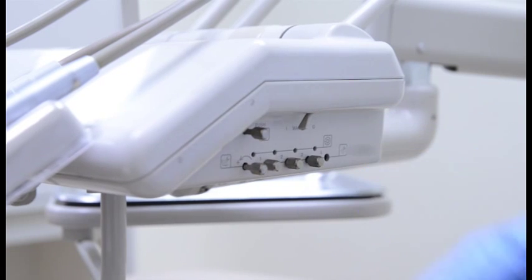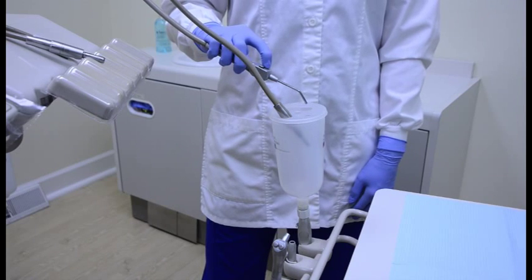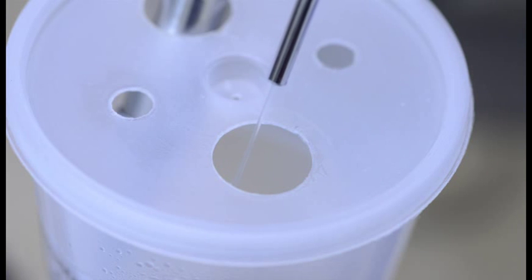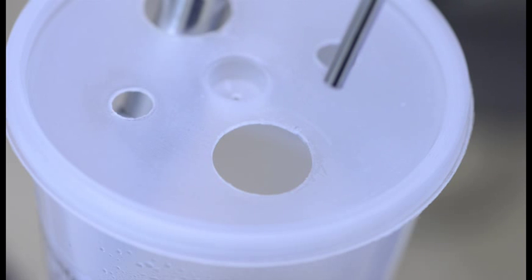Turn the dental unit on. With the handpiece hoses and air-water syringes in the assistant, activate the foot control and air-water syringes until Mentoclean comes out. Once you see Mentoclean dispensing, stop activating the instruments.